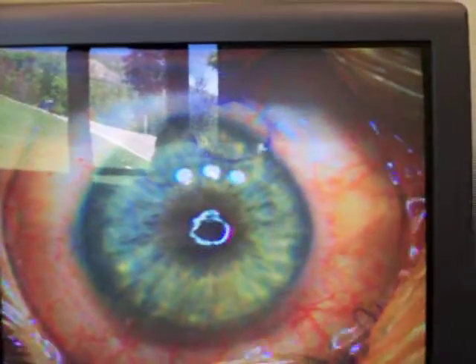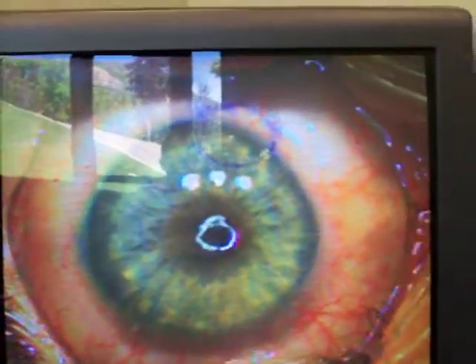You can see the edge right there across there. It'll literally just suck down. And if he would have to, he'll look at it in the slit lamp here and have a look. And if he sees a piece of lint or something underneath the cornea and he goes to lift it up, you'll see him go under it to lift it back up. Yeah.